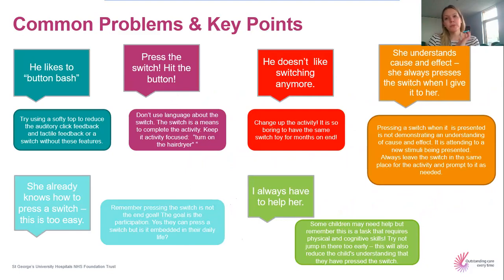And press the switch, hit the button. What we're trying to encourage is not to use language about the switch. The switch is the means to complete the activity. So we want to be using activity focused language. So turn on the lights, turn on the hairdryer, and making sure it's activity focused.